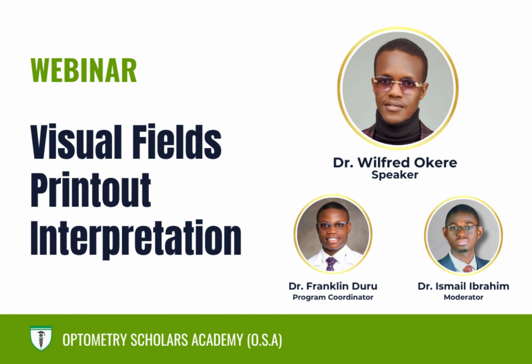We've answered the first question in the chat box. So we'll be attending to the second question, which is from Scholar Hamilton Kiza. He's asking, what are catch trials?